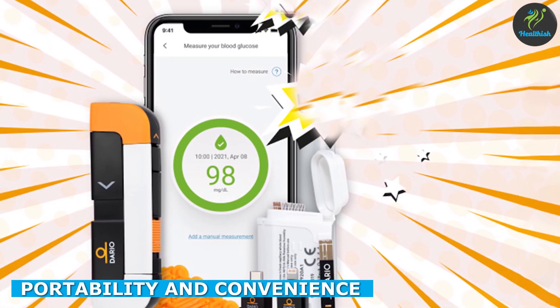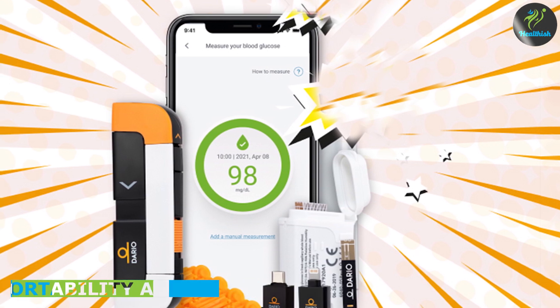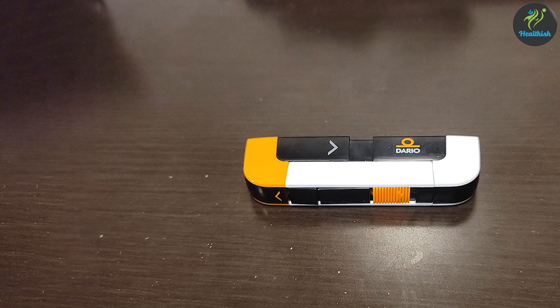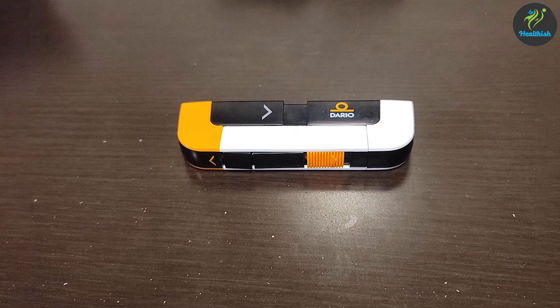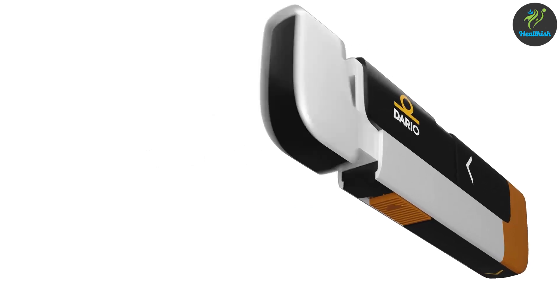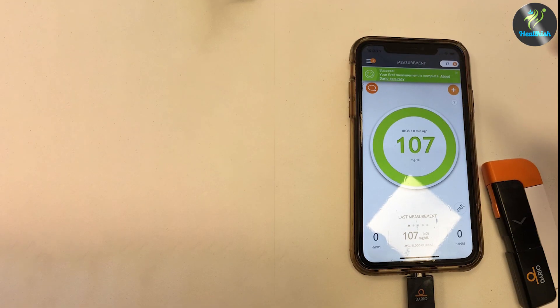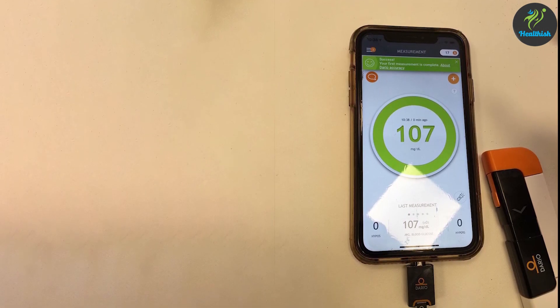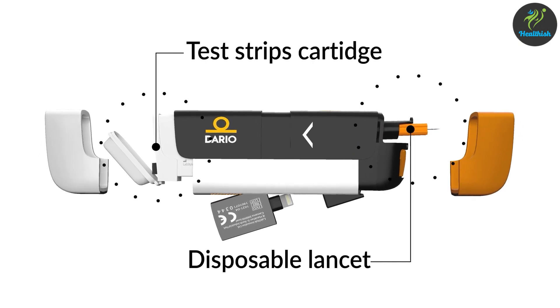Gone are the days of carrying a separate glucose meter and a smartphone. With the Dario Blood Glucose Monitor Kit, you have everything you need in one compact device. Its portability and convenience make it an excellent companion for individuals with diabetes. Whether you are at home, work, or traveling, you can easily monitor your blood glucose levels on the go. The device's small size and compatibility with your iPhone make it a game-changer for convenience.